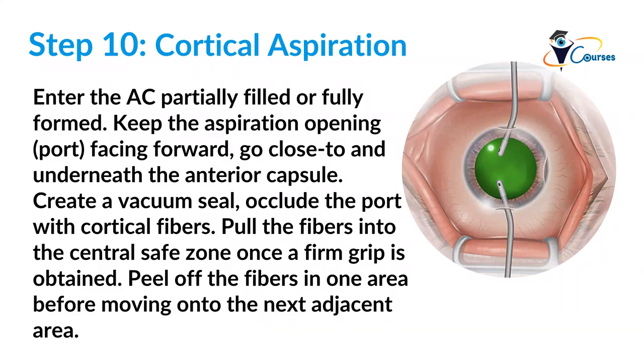If this didn't happen, then the key here is to have low vacuum. The problem is that when most surgeons find that the nucleus is not getting to the phaco probe, or it is emulsified by the probe, and you are not able to grasp the nucleus in order to chop it, what do you do?